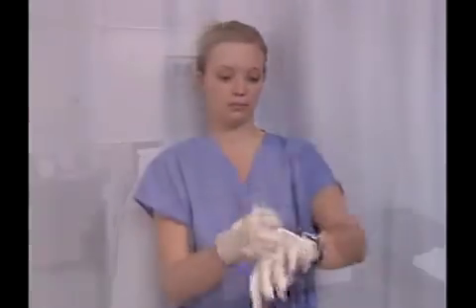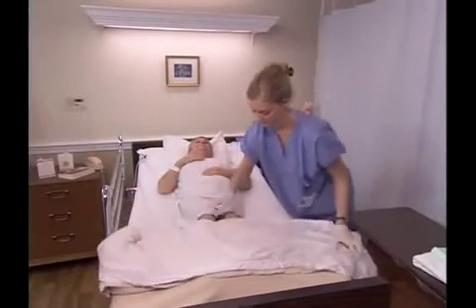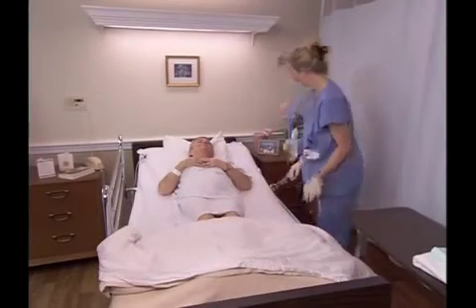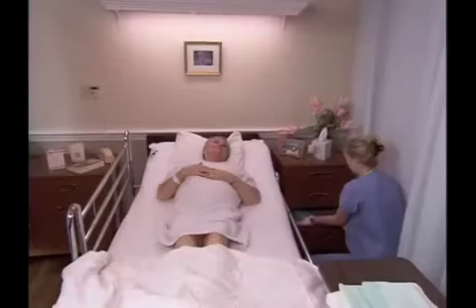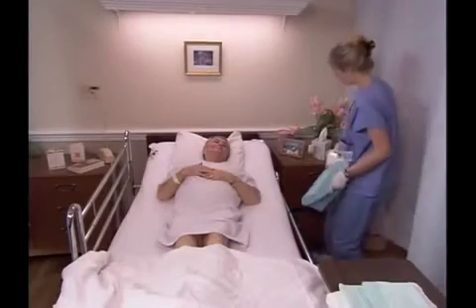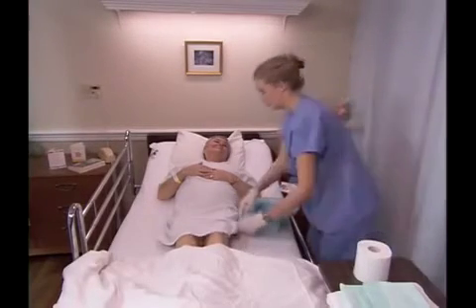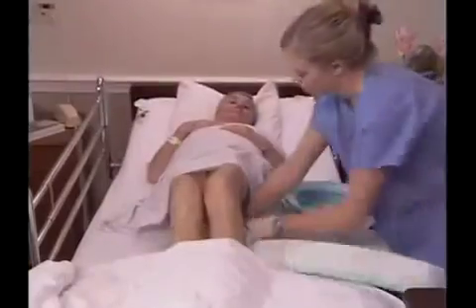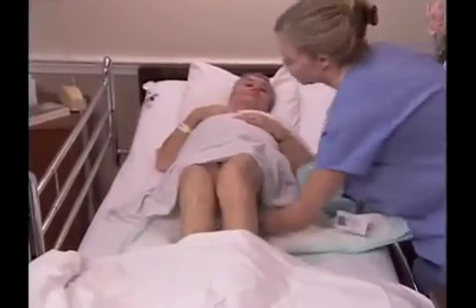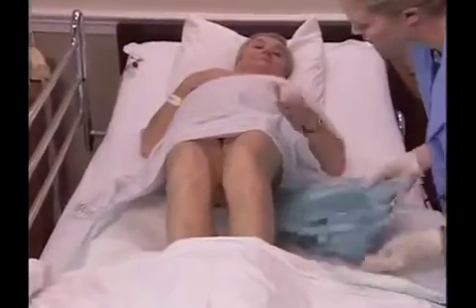Next, put on your gloves. Fan fold the top linens to the foot of the bed. Adjust the person's hospital gown or pajama bottoms as necessary to expose the person's buttocks. Slide the bed protector underneath the person's buttocks. Then place the bedpan.